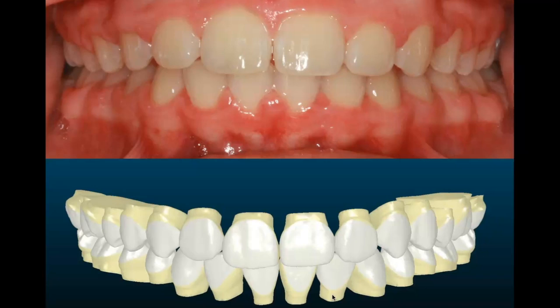So the newest kid on the block when it comes to this kind of treatment as far as complete customization is called Light Force. Basically, it's the same exact concept, except instead of using metal brackets, they use ceramic brackets. And those ceramic brackets are 3D printed, so they're stronger. Now there are some challenges with ceramic as well, right? They're harder. You can wear down teeth if you're not careful. You have to have bite ramps, things like that. But it's the same exact concept. My youngest daughter is actually in Light Force treatment now, but we'll see how that pans out. But yes, that's 10 years ago is what that looked like.